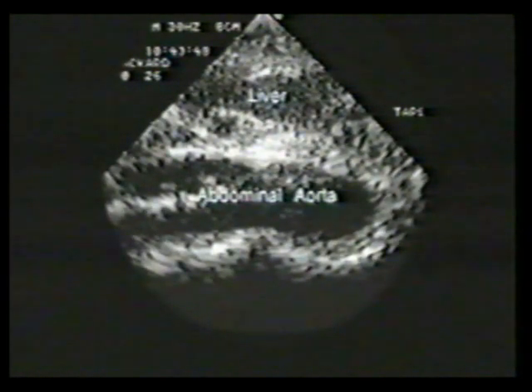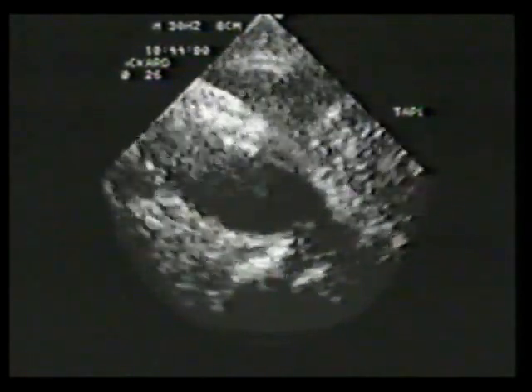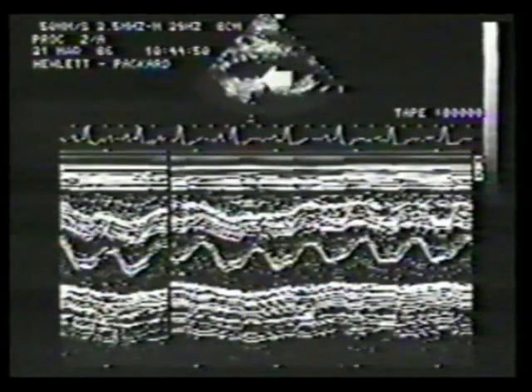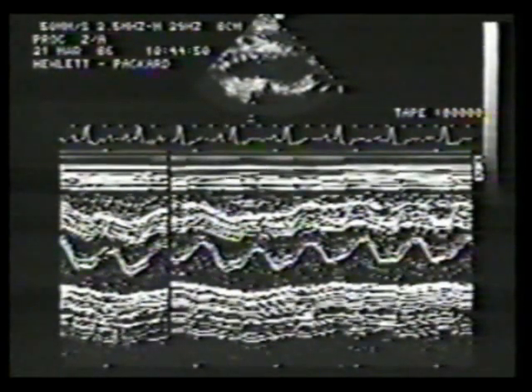Surface echo is also well suited for identifying flap in the abdominal aorta. Using a subcostal transducer position, this thickened intimal flap was identified in the abdominal aorta. A cursor was guided across the abdominal aorta and the mobile flap is clearly evident on the M-mode tracing within the aorta. This patient underwent surgical repair of her type 1 dissection. The surgery was successfully performed immediately following the echocardiographic diagnosis without any additional procedures.